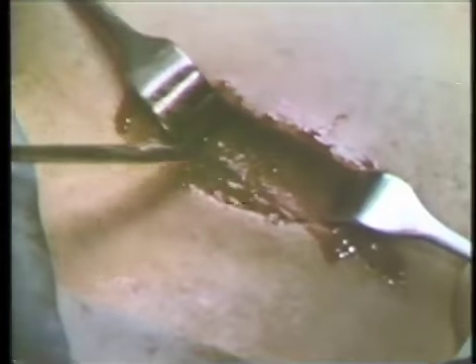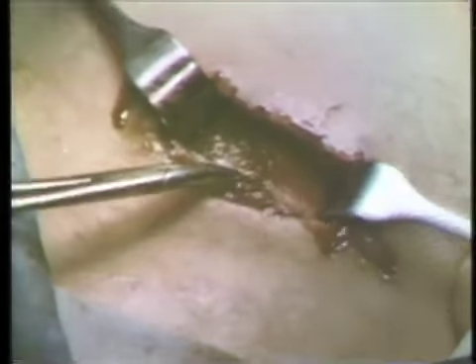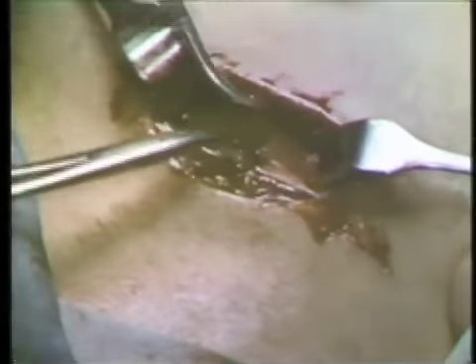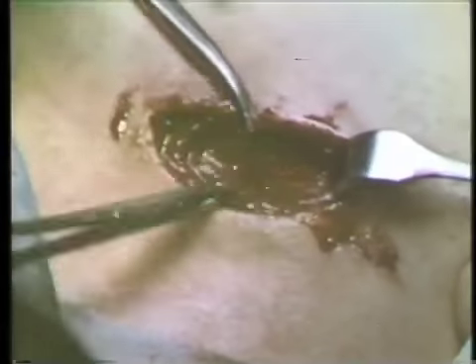That vessel will be individually clamped and ligated. It directly crosses the path. It's not a major vessel. It's not the facial artery or vein. It's just a small tributary of that system.